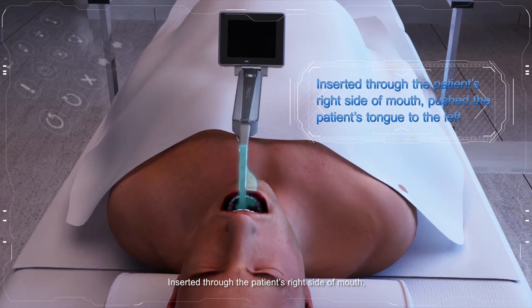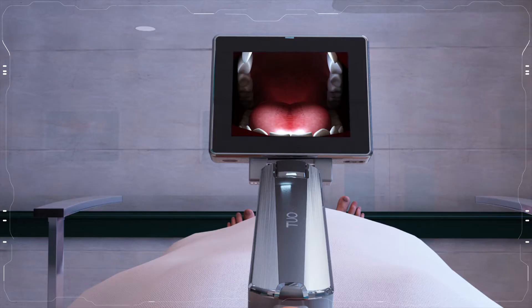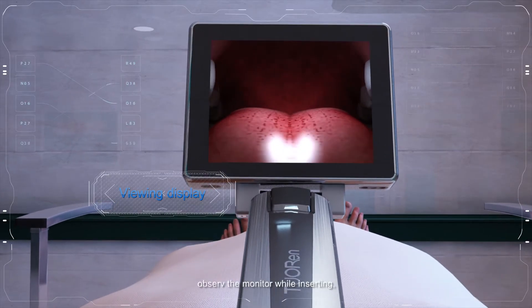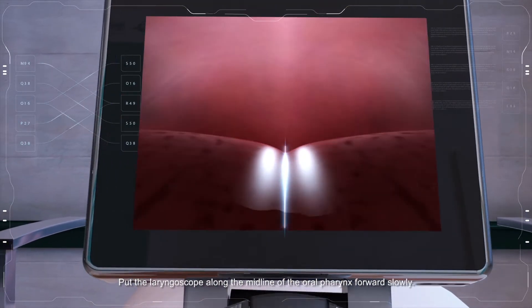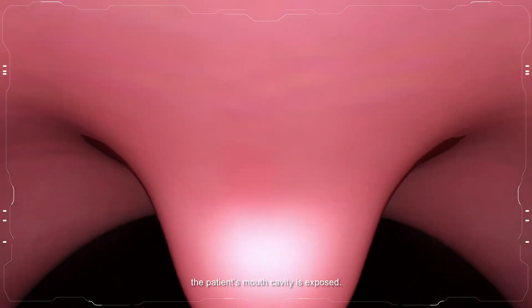Insert the laryngoscope through the right side of the patient's mouth, pushing the patient's tongue to the left. Observe the monitor while inserting. Put the laryngoscope along the midline of the oral pharynx forward slowly until the patient's mouth cavity is exposed.